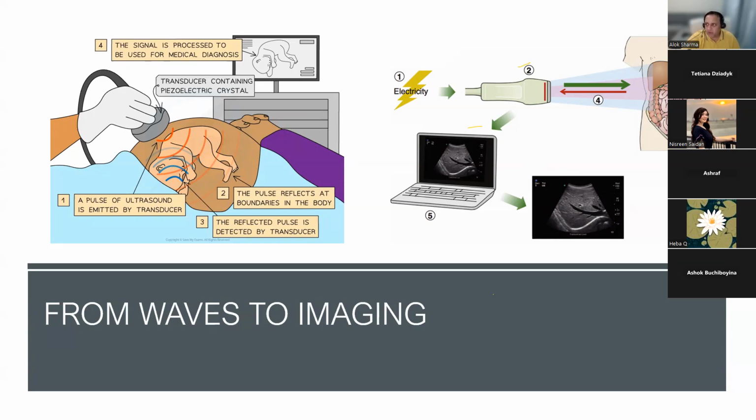This is quite an important concept because when you're looking at lung with an ultrasound, you're not really looking at the internal structure of the lung as an organ. You're looking at artifact, which is basically like a mirage. It's the interaction of sound waves with air in the lungs, the alveoli, the interstitial fluid, how the sound waves get trapped, reflect back, and those interactions produce patterns.